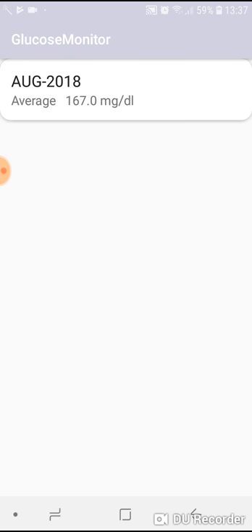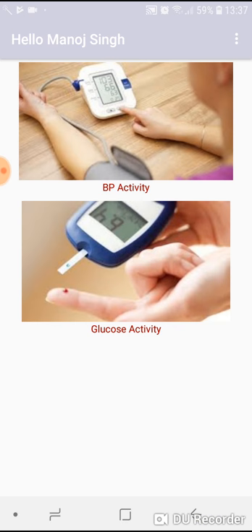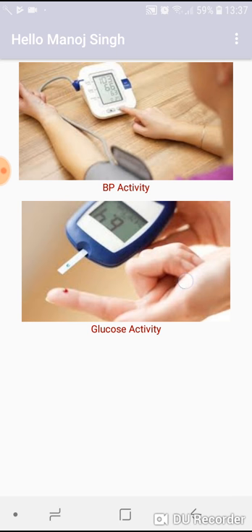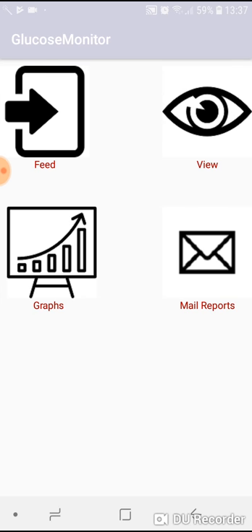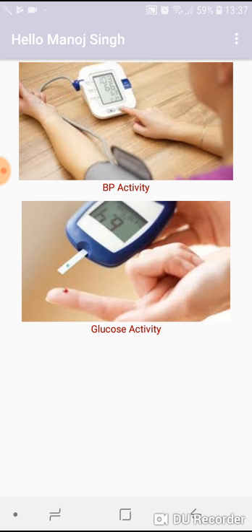This is how it works. One advantage of this application is that your parents or your children can have the application installed at their mobiles as well and they can monitor your day-to-day progress of your health. There are many applications who charge premium for mailing CSV reports, but this application is quite free.